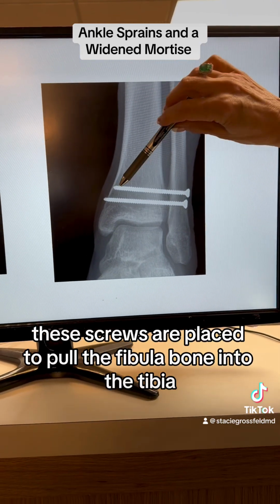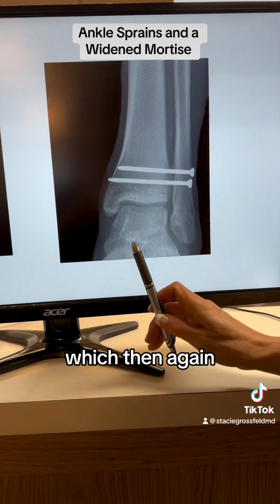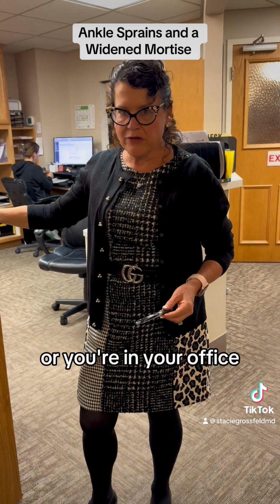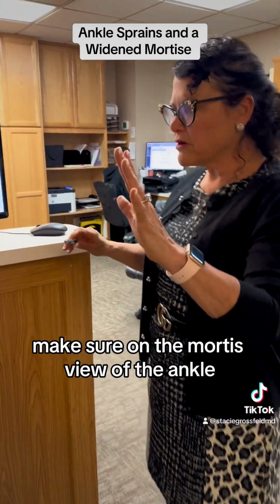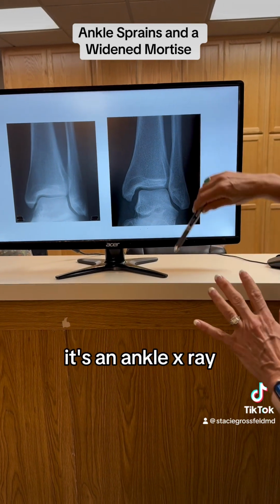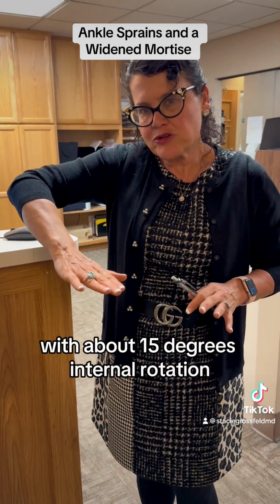And these screws are placed to pull the fibula bone into the tibia, which then again reduces that syndesmotic injury. So if you're moonlighting or you're in your office and you get x-rays of an ankle, make sure on the mortise view of the ankle that you look. This is called a mortise view. It's an ankle x-ray taken with the foot with about 15 degrees of internal rotation.